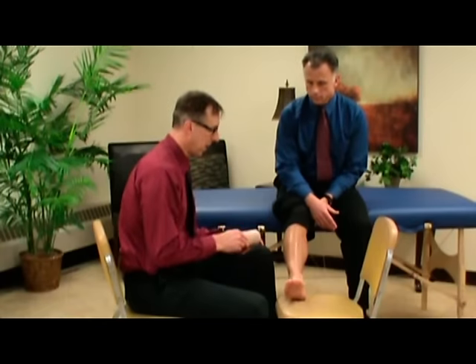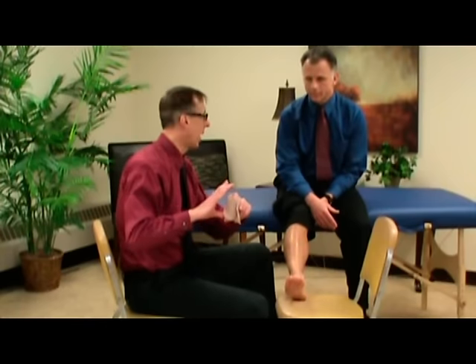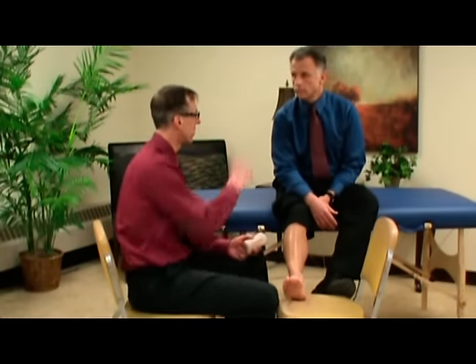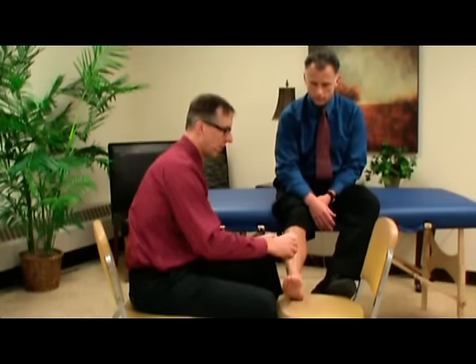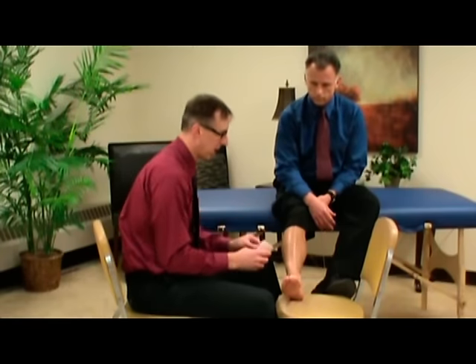We have an ACE wrap here — this is the stretchy kind. I really don't want one that's too wide; it's going to be very difficult to handle. Probably the more narrow ones are easier. This one is three and three-quarter inches. Some wraps have clips, some have Velcro now.